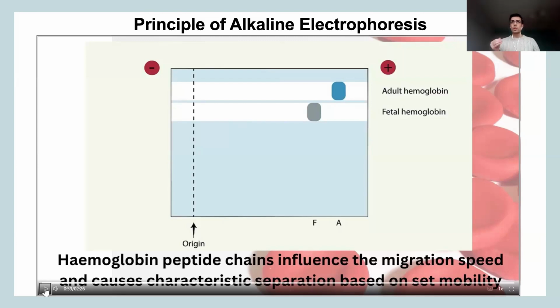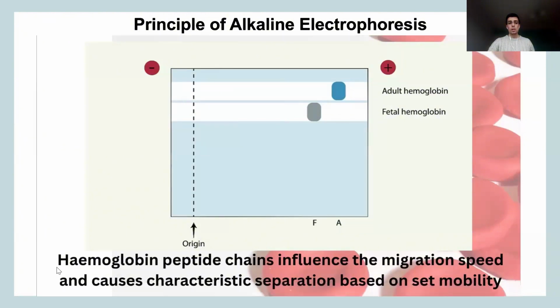So you're going to see a pattern, which is quite nice, especially when you're training someone or you want to take a systematic approach in diagnosis. That pattern is going to be quite important for you to have a consistent reporting strategy as well.